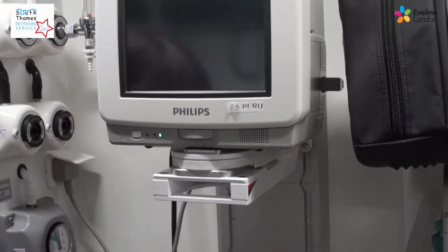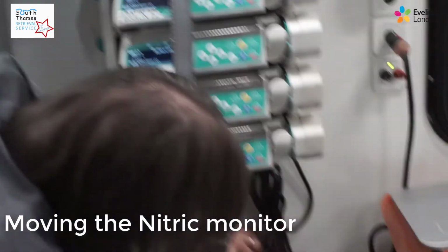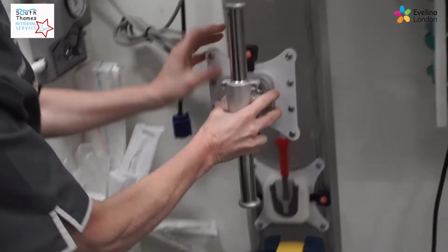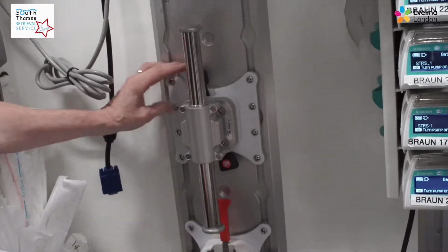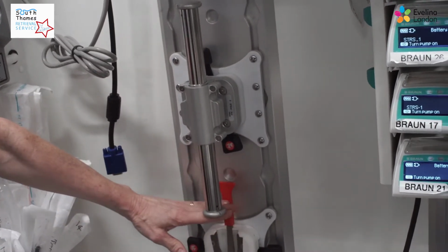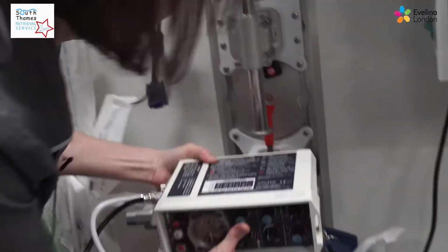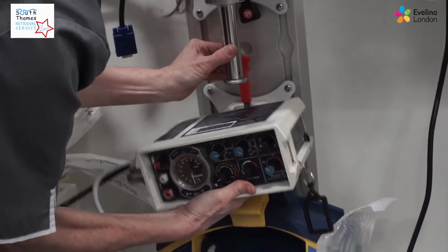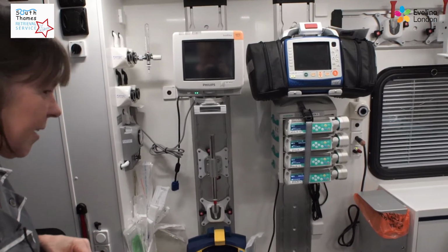Okay, so now you've got an area where you can put your nitric monitor. So again, to move this, you need to lift forward the pole clamp and then reposition this back onto this active wall and secure the black lever into the diagonal. Now it looks like it's very close to the handle, but we don't actually need to take that off. So just to demonstrate, it locks in place there and you can lift it off. It's always a bit stiff with the new equipment. So this is now the position of the equipment ready to take the nitric monitor and blender.